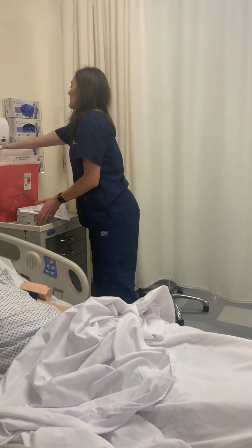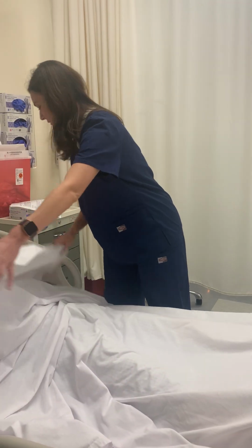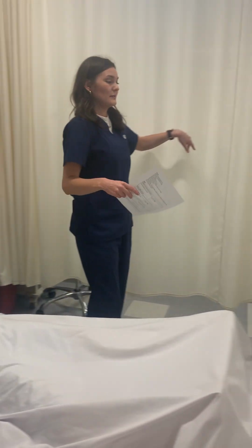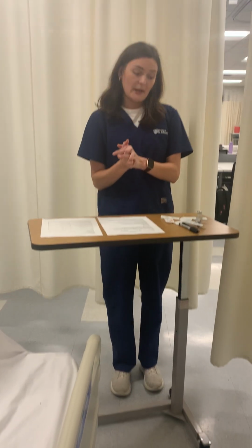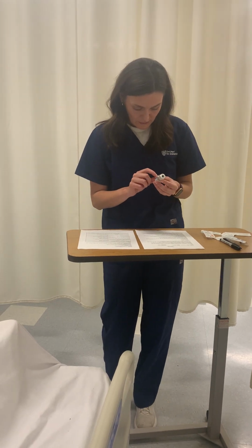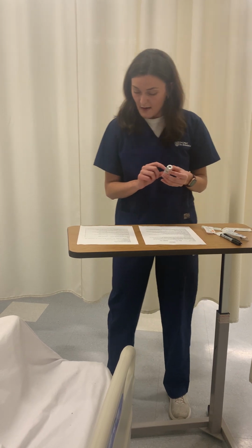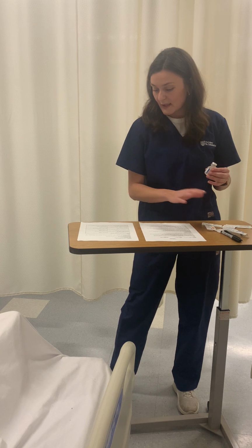Okay. Okay, so hand hygiene. Make sure the client is comfortable. Make sure the bed is low. Okay, it is. They have their call light. Open the curtain. Okay, so now I'm going to prepare the vaccine. So I'm going to begin by removing the medication from the storage unit. And I've got Fluzone. Okay, it matches. We're doing Joanne Peterson. Nice. The dose, we're doing 0.5 mL. 0.5 mL, we get there.